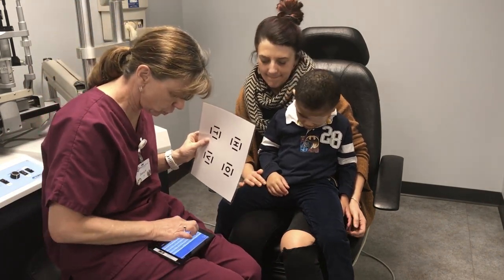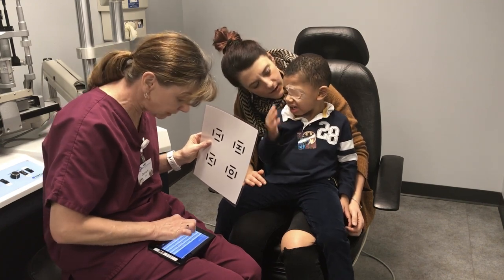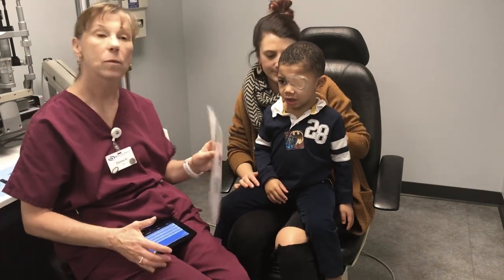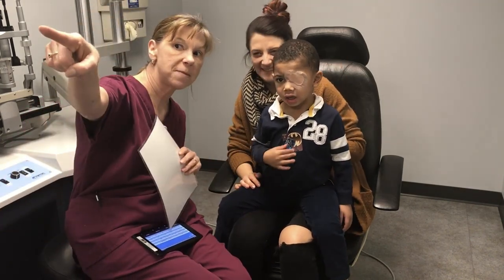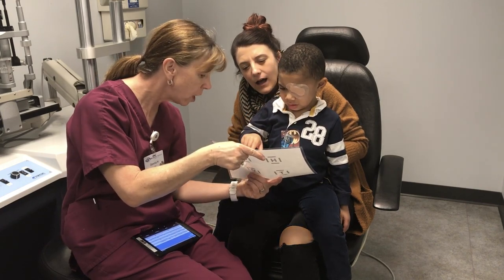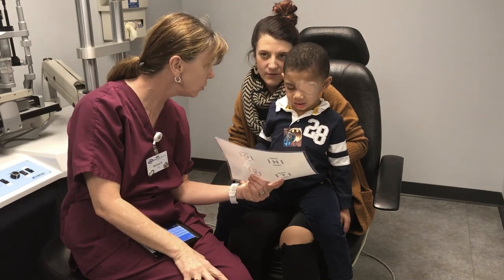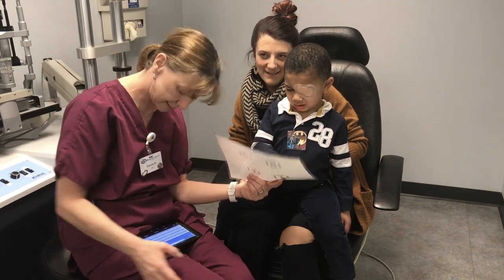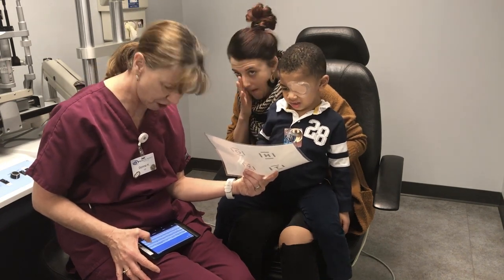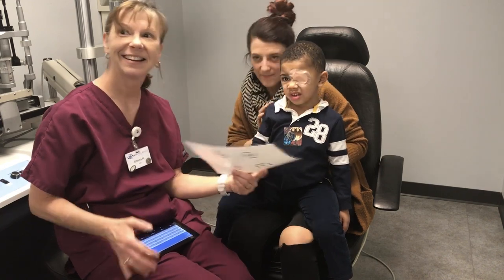Okay, now we're gonna do this. Almost done. You were being so good with that. Would you like some stickers? It's part of the game, buddy. All right, we're getting some stickers. Look up there. Do you see that? Can you point to the same one here? You're right. That's the O. Look up at that one. Can you find that same match? It's the T. Very good. What about that one? Awesome job. Can you find that? Oh, yeah. There you go.